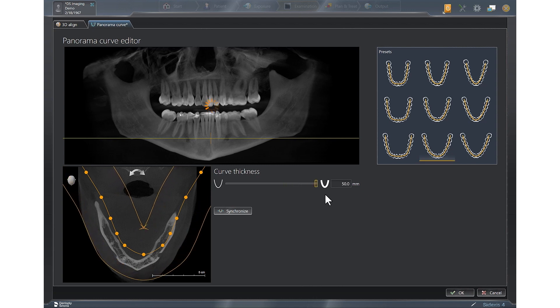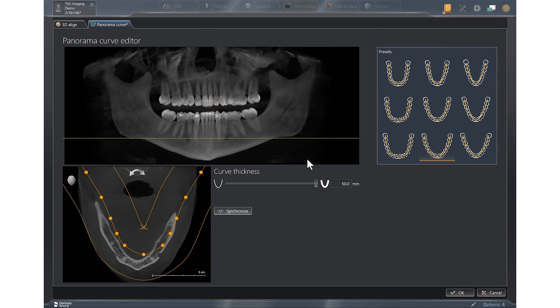Set curve thickness to 50.0 millimeters, and you can see by doing this additional data will render into the pan. Lastly, you're going to come down to the arch form and select inside or outside the dotted lines.